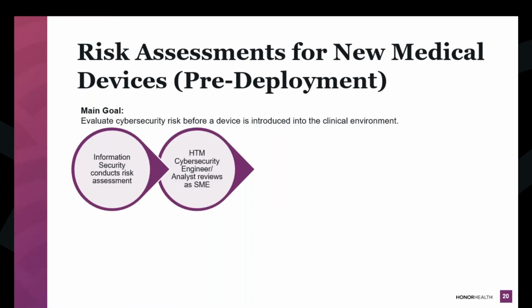But before it goes to your CISO or the director of information security to officially sign off on that risk assessment, they're also looking for your input. They want to know, from a Biomed perspective, the people that are touching this equipment every day, is our assessment correct, right? We're evaluating this device based on what the vendor is telling us. But you guys are really the experts in saying that's not how it's deployed out here. So get involved in that process, and be the SME in that process, and provide that sign off.